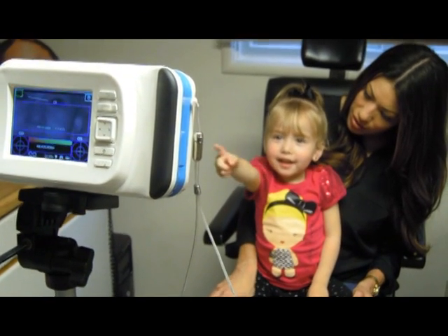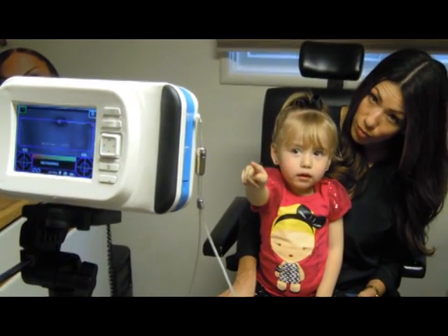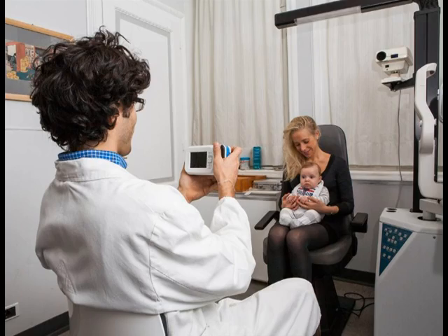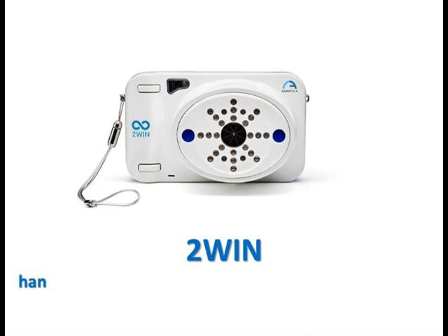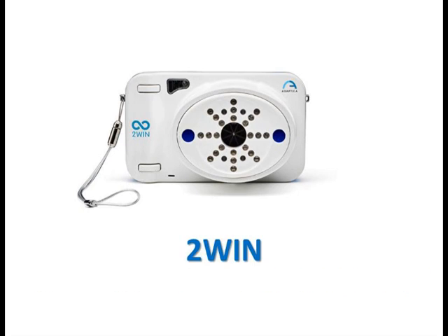Please remember that free space, non-cycloplegic refraction can vary depending on several conditions and parameters pertaining to the binocular visual function. In some specific patients, including accommodating children, the 2-WIN measurements may vary. The 2-WIN is the most innovative refractometer. Detect any patient's real-time refraction in the most natural vision conditions.